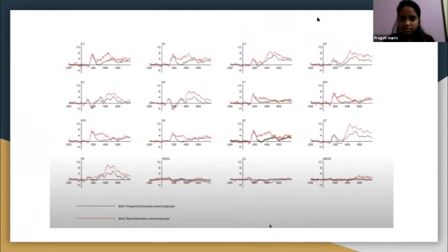One second. Let's just stop sharing. So how to import those events on the same plot? This is done through bins, the bin descriptor file. In bins we mention those event codes for when the rare stimulus was present. From there we average those using the bin descriptor file, and we just proceed.